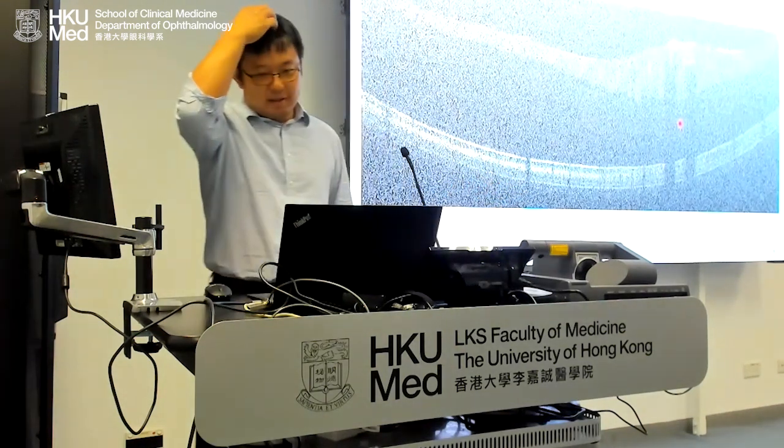Another headache, like I mentioned, is that getting a system from scratch is really challenging. I called Zeiss, I called Heidelberg, I called all the major manufacturers: hey, can we collaborate? They said no, we don't care. And I said, okay, that's fine. We'll do it by ourselves. So the speckle was dealt with, but the human scan needs a higher speed.